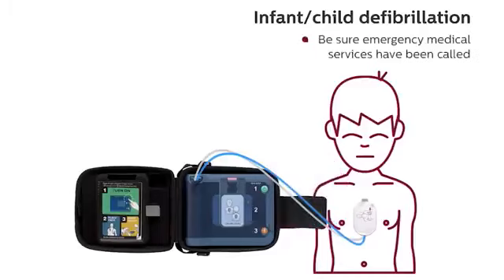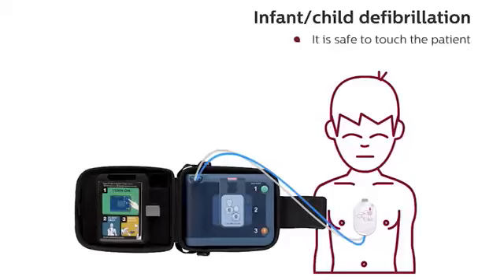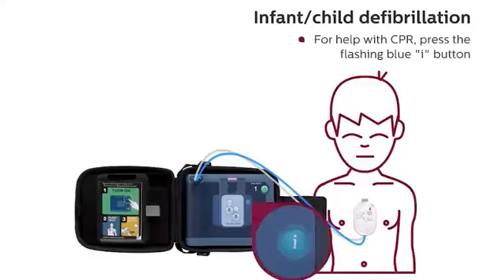Shock delivered. Be sure emergency medical services have been called. It is safe to touch the patient. Begin CPR. For help with CPR, press the flashing blue button.